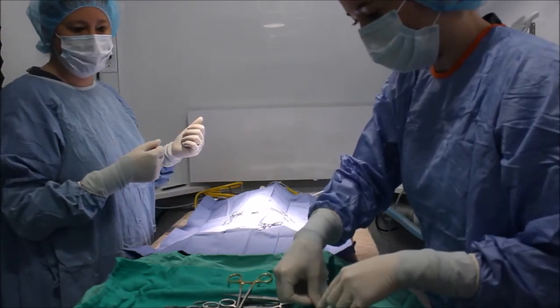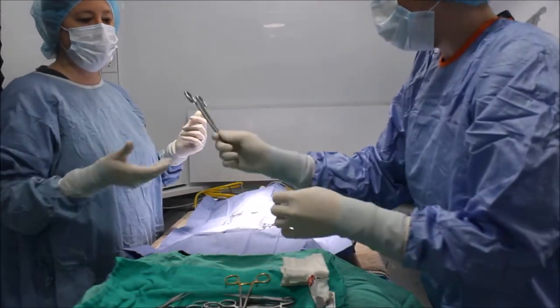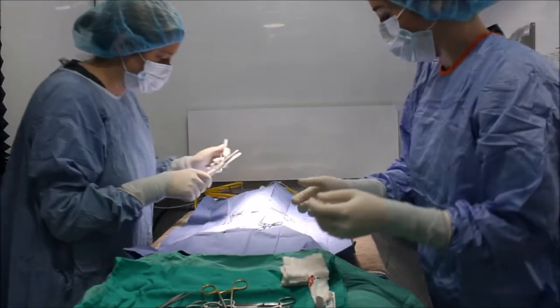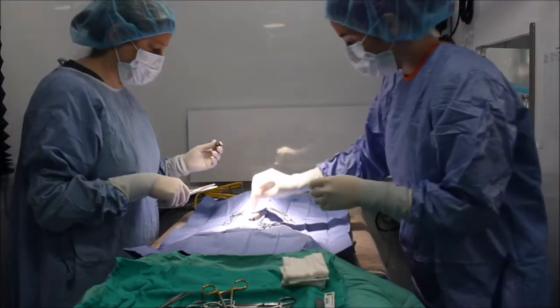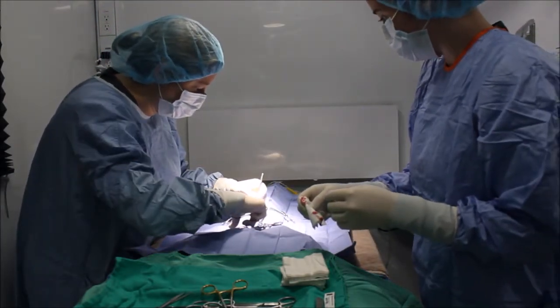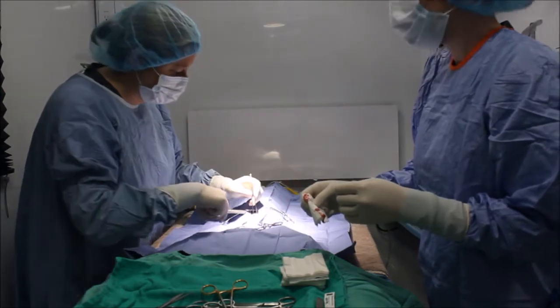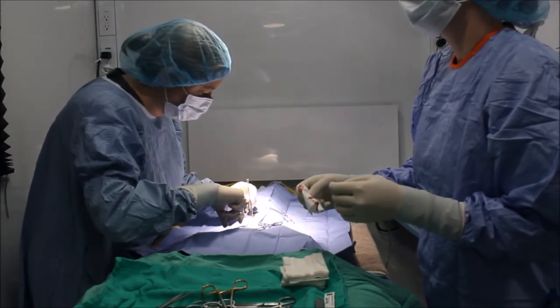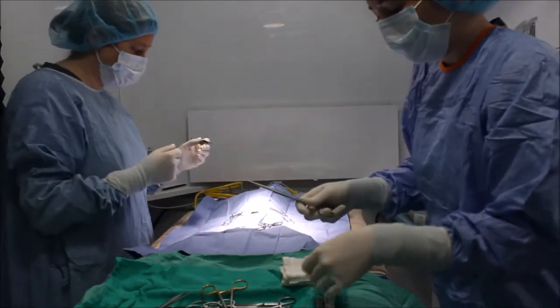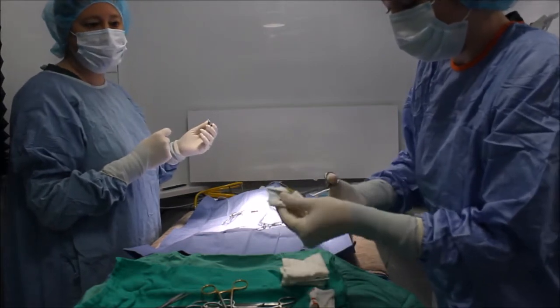I'm going to make sure I know where my sharps are at all times. As instruments are returned to me, I'm just going to wipe those off.